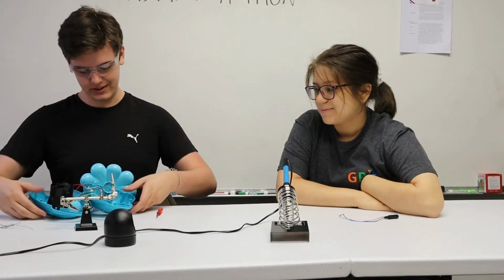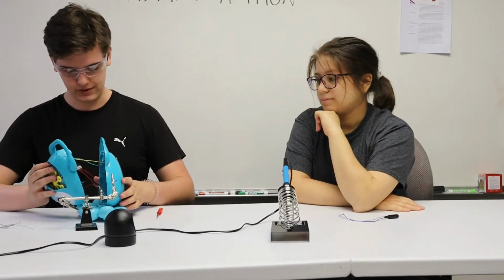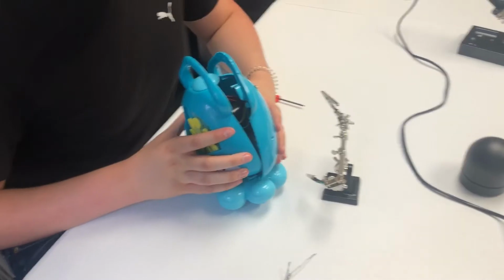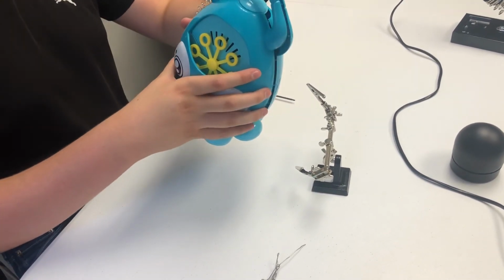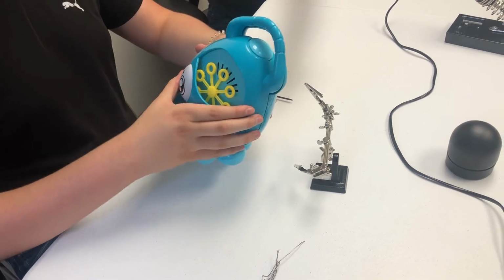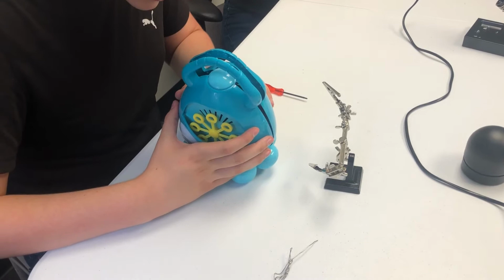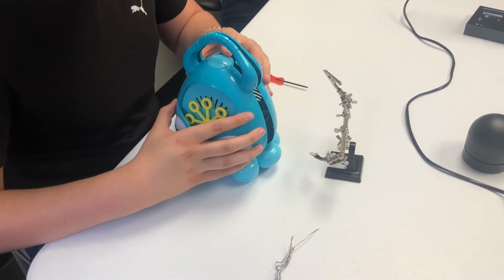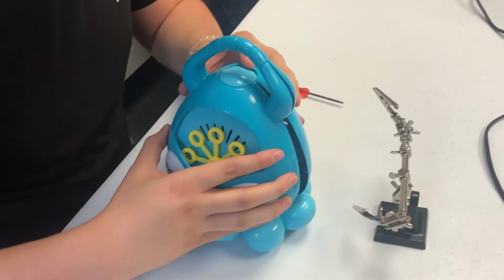Okay. So now I can put this whole thing back together. Yep. Alright. So I'm just trying to watch the wires in the middle here. Does that go back together? On the top. Yeah, I think we're good. There's plenty of space in this one, so that makes it a little easier. Yeah. Just make sure that the top part with the button slots in under the top of the casing here. Right? Like that? Yes. Yeah, okay.